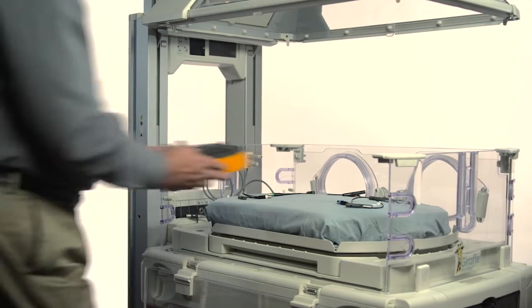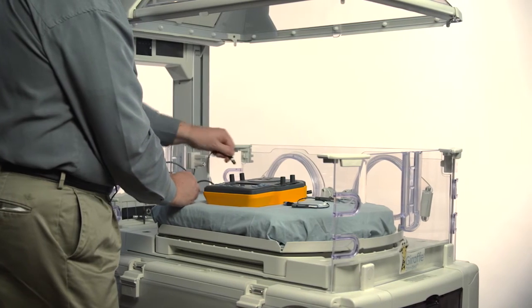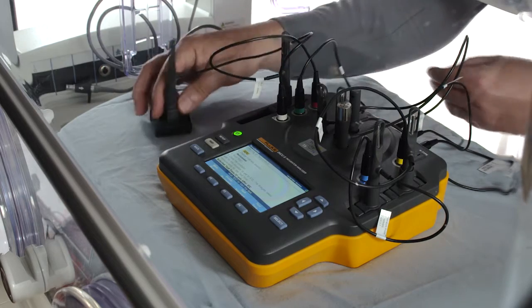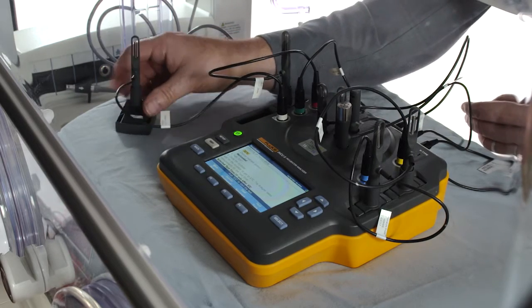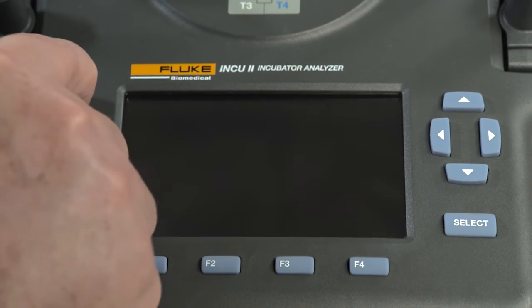To start, place the INQ-2 in the incubator or radiant warmer you're testing. In this scenario, we're going to test an incubator. Remove and set up the temperature tripods and sensors, and position them in the middle of each quadrant of the mattress. When you first turn on the INQ-2, it will do a self-check.